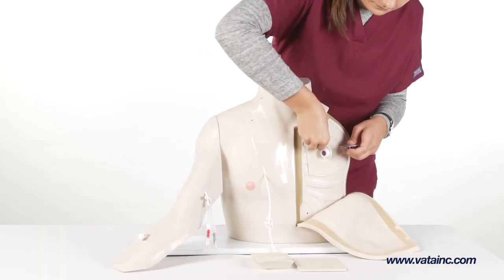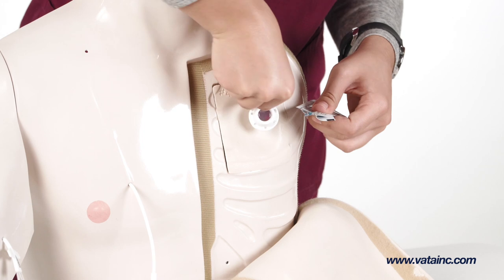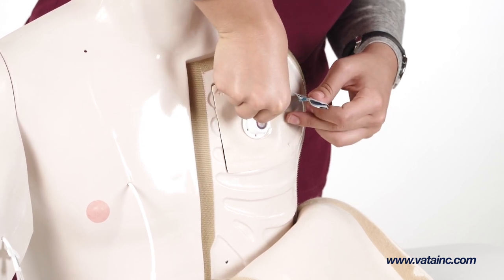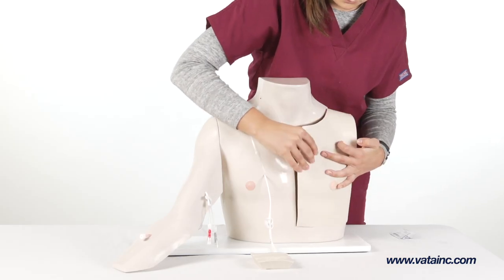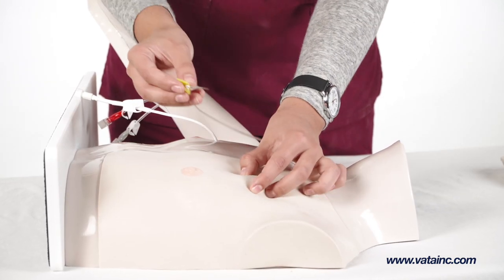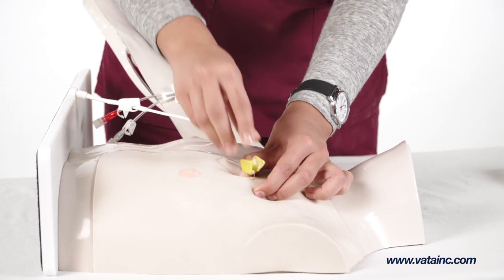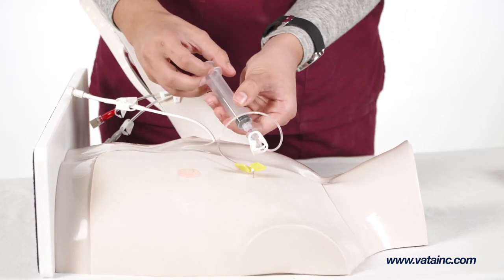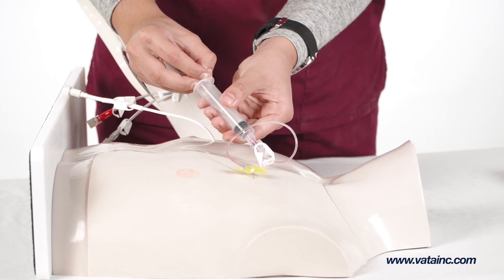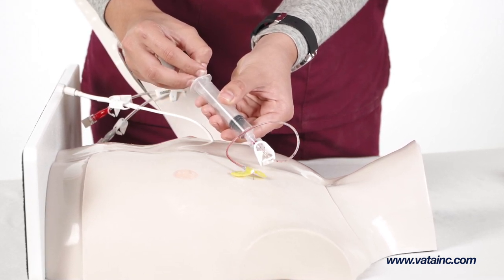To simulate a wandering port, place lubricating gel beneath the port until the port slides around freely. To perform an access on the port, lay the Chester in a supine position and using a Huber needle access the port through the skin flap. Proper placement is confirmed by a blood return.